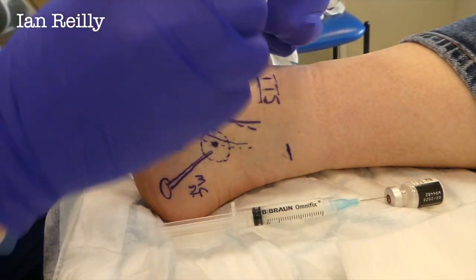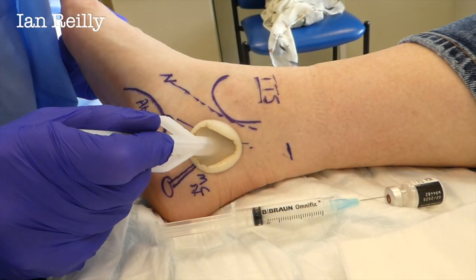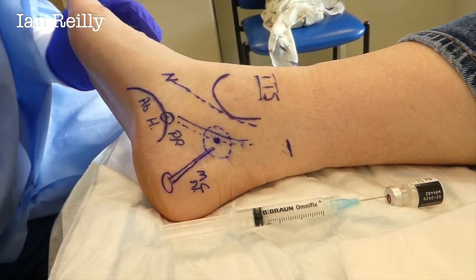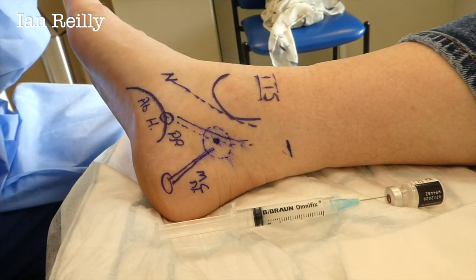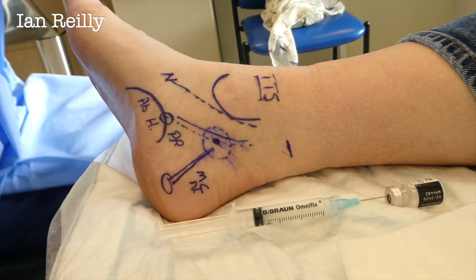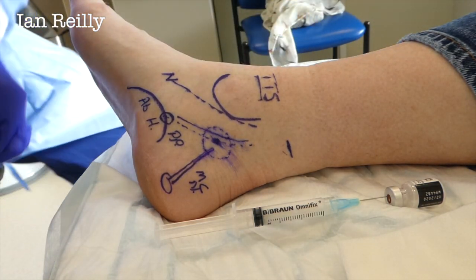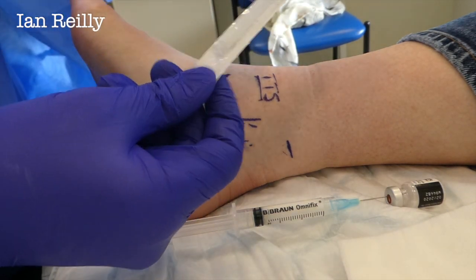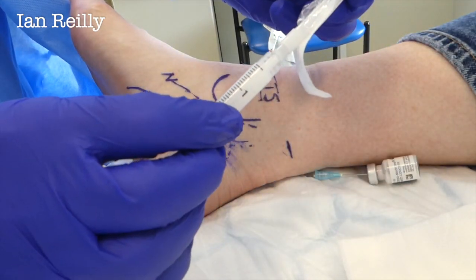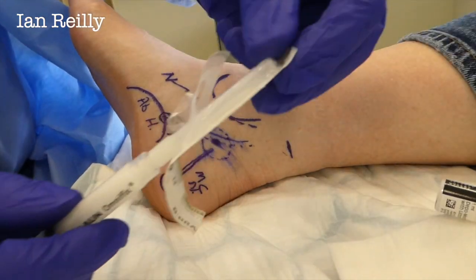Some skin prep — I love these chloropreps. I tend to just get them going on the back of my glove and dab, because I don't want to mark off all of that beautiful purple — I want to see where I am. For this lady I'm going to use a 27-gauge needle, just because it's nice and skinny. I generally like a blue needle but for this lady we're going to use a 27.